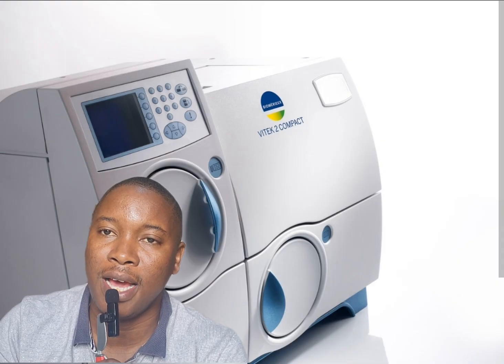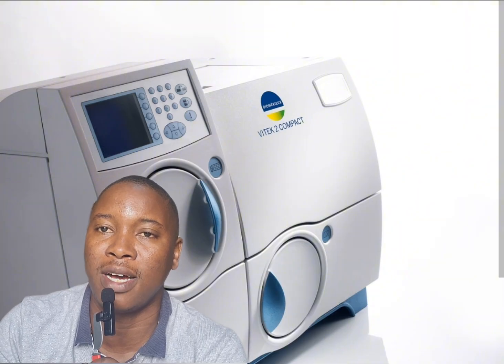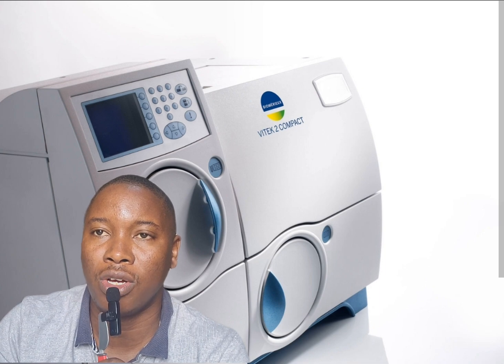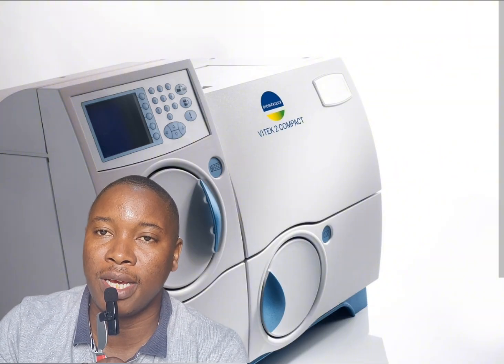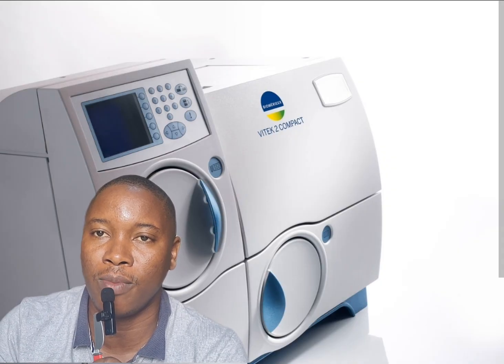So we simply have a sample. It can be a food sample, water sample, urine sample, fecal sample, whatever sample it is. Then we take out of that sample and we inoculate onto culture media. And after inoculating onto culture media, we then incubate for a couple of hours, about 12 to 24 hours, and then we see microbial growth.